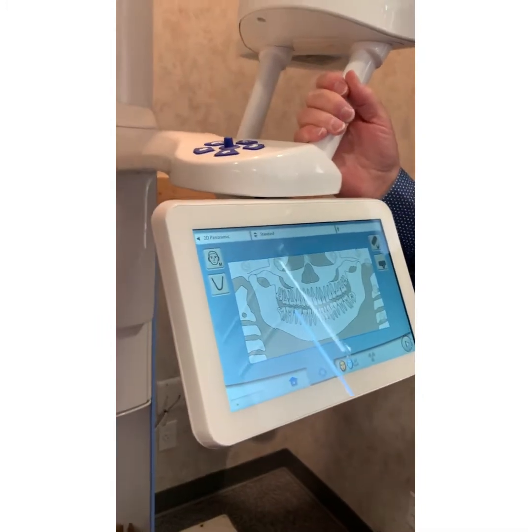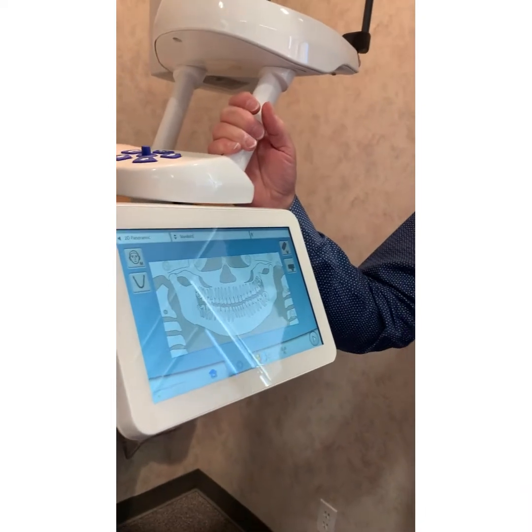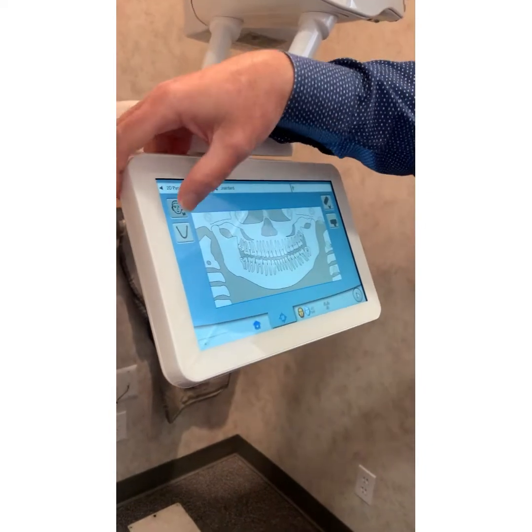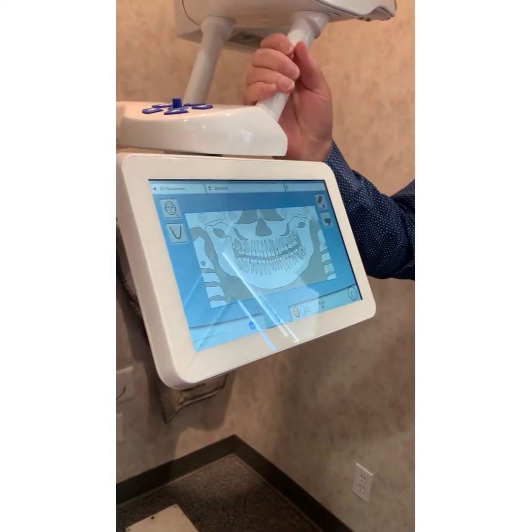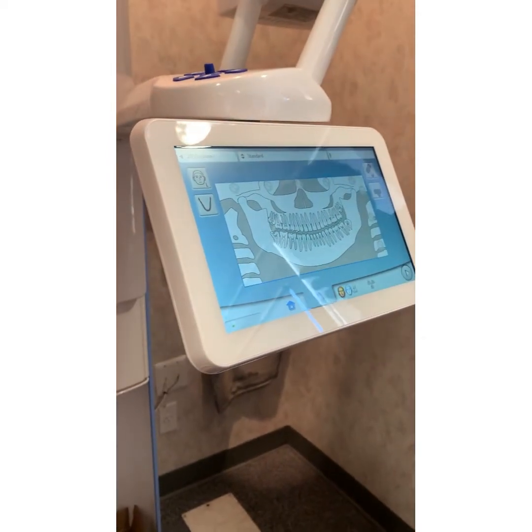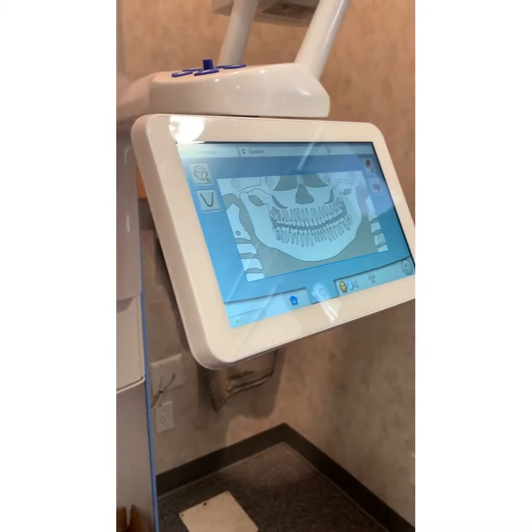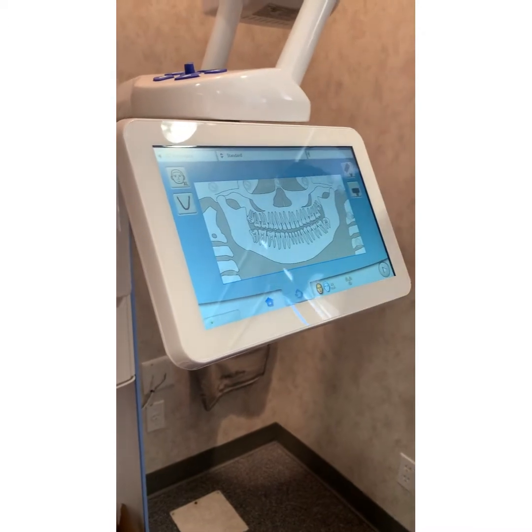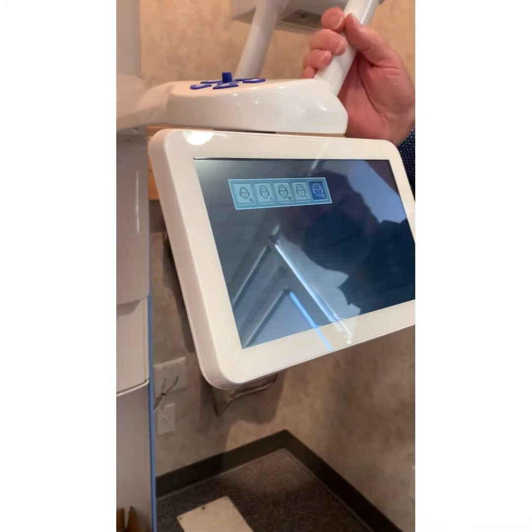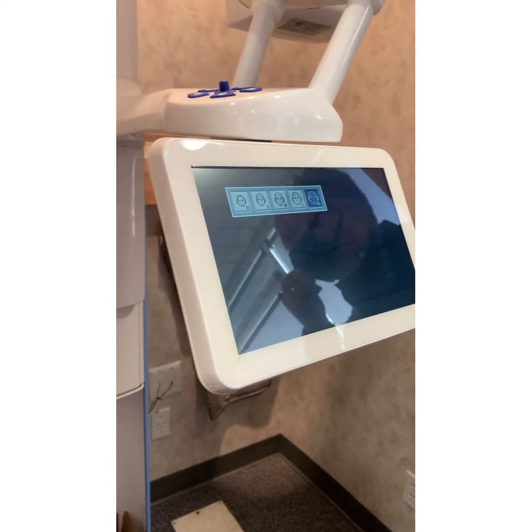If you call a different technician, this is right from a physicist in Finland, who explained to me how they design this. From his lips to my ears, this is what he told me. And this L is for some of your friends whose ancestry brings them closer to the equator. I've got a buddy who's Samoan, and you can tell there are bone densities at work that require a little bit more juice and velocity to capture an image. I've never, ever used XL. Extra large? Yeah, the bubble setting. Extra dense. At Camp Pendleton, these big kids walking through were hitting L and XL, and they were burning all the images out, because at 18, 19, you still got puppy bones, even though you're 6'5" and look like you're benching 600 pounds.